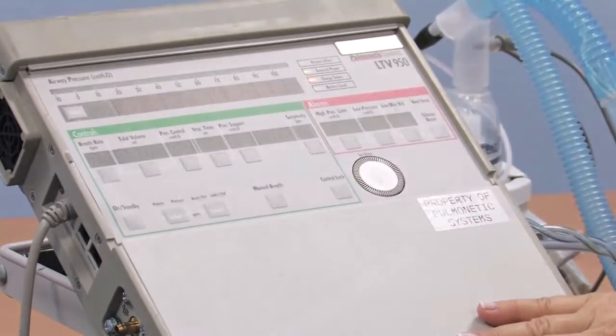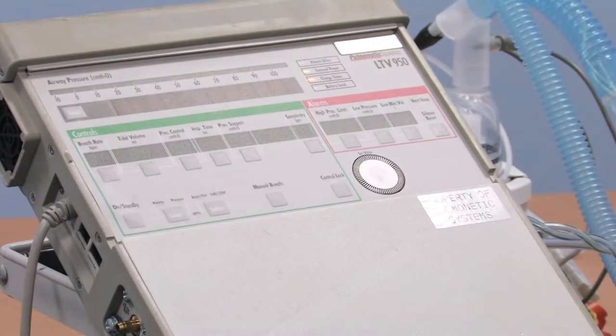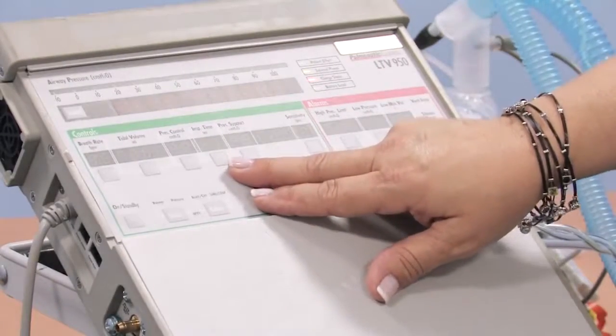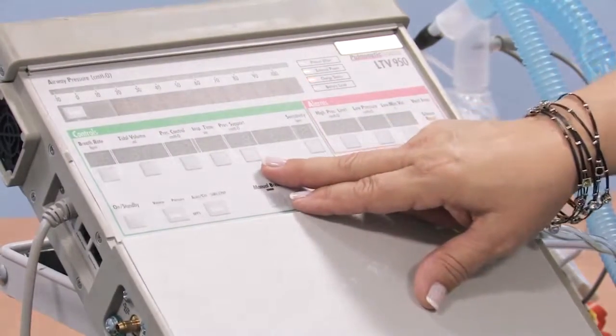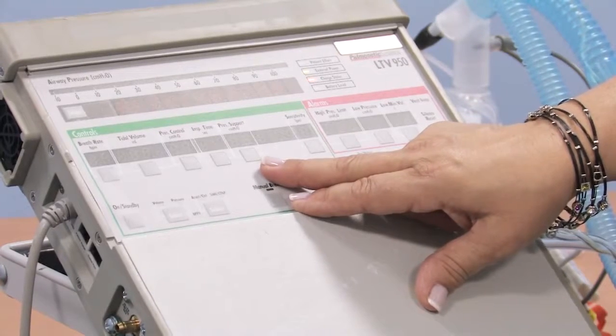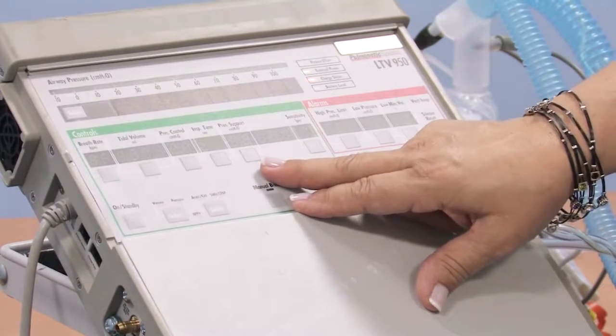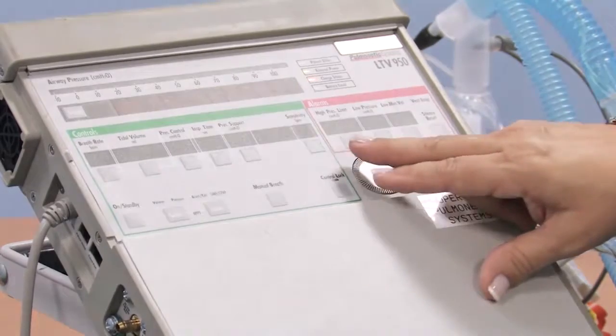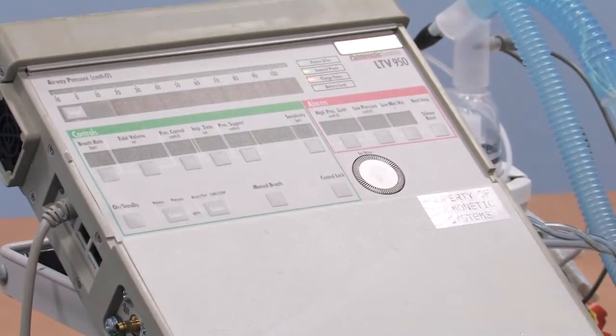So an average inspiratory time would be probably 0.6 to 0.8 seconds for a little tyke and closer to 1 second for more of an adolescent child. That will also be prescribed and set. If the child is receiving pressure support in conjunction with the mandatory breaths, the pressure support will be lit here as well. Sensitivity.